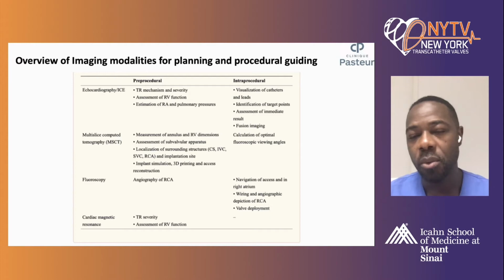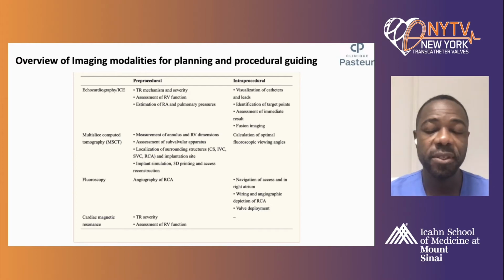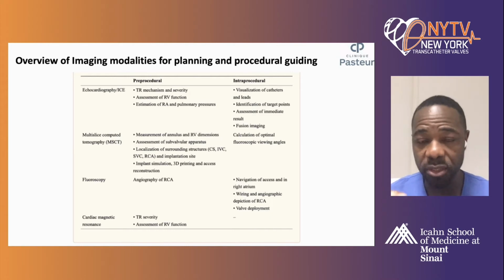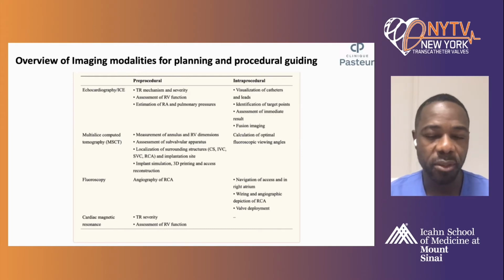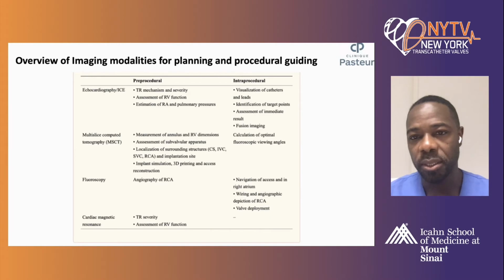While when you go more into the procedure, the guiding through the procedure, it's really helpful to visualize the catheters and the leads, to identify the location of the jets and the target points, and to assess the immediate results. We may also use fusion imaging when it comes to echo guidance.